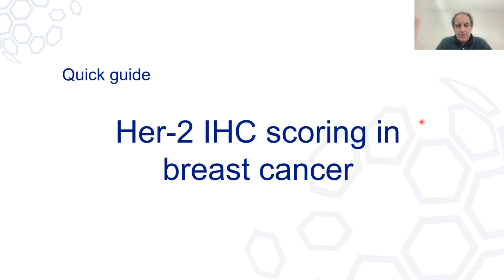Hello and welcome to our quick guide for Her2 IHC scoring in breast cancer.